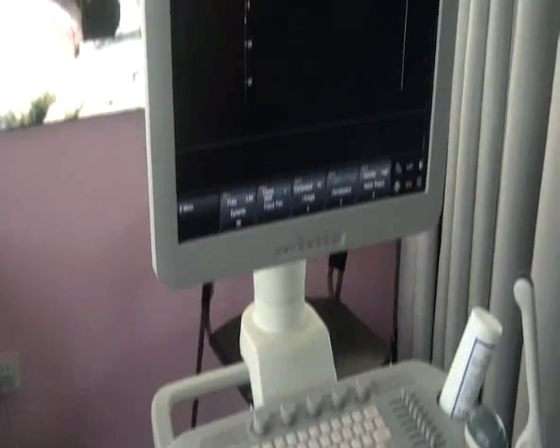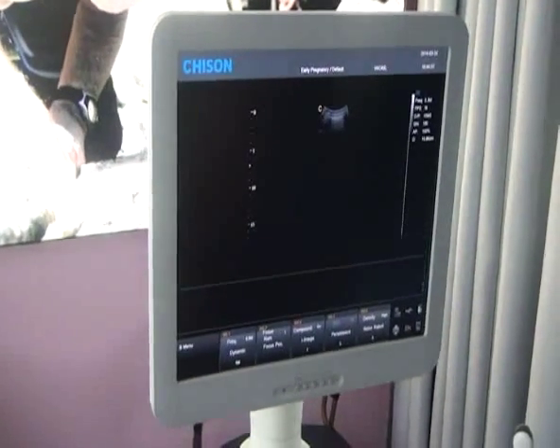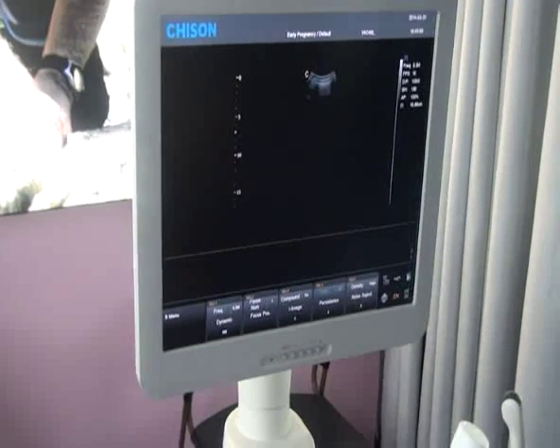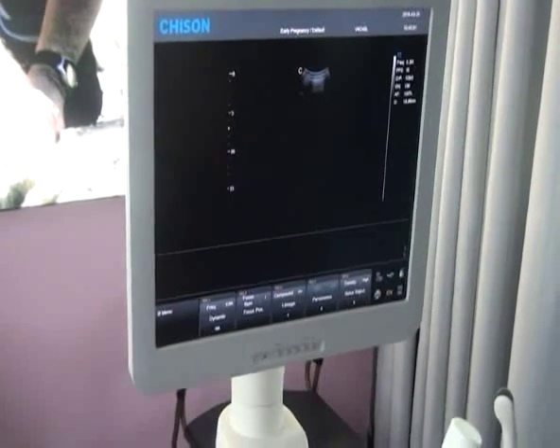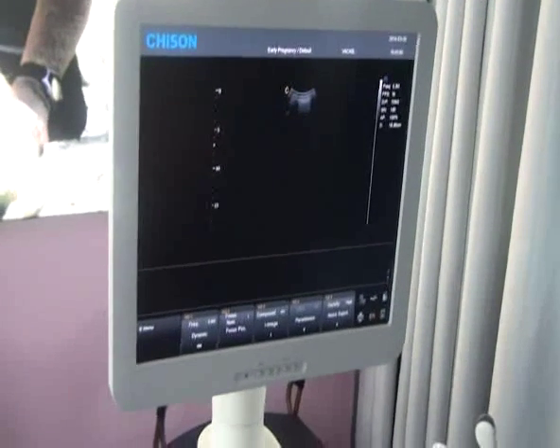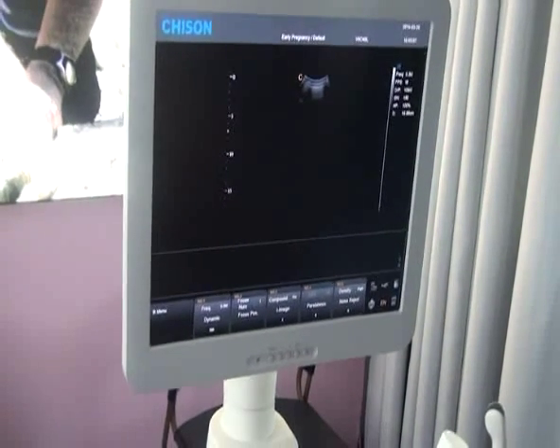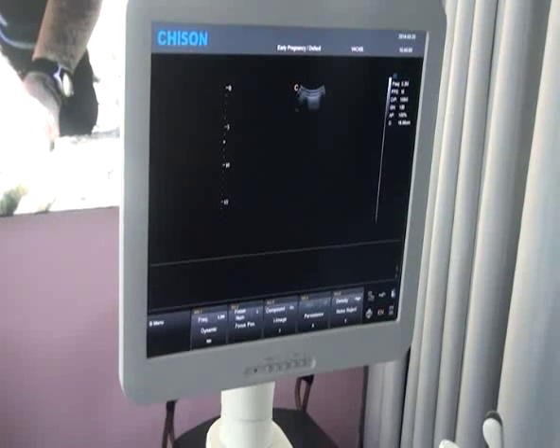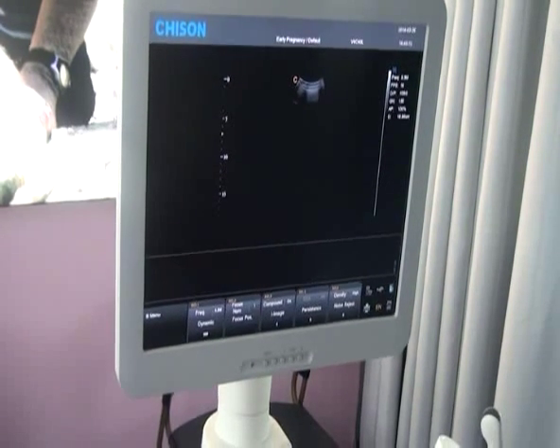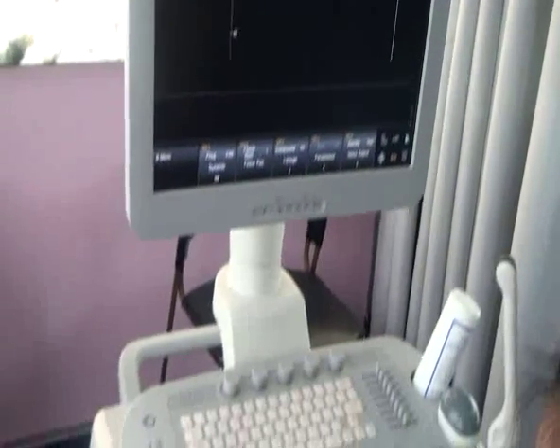Hello, thank you for choosing Chison. It's my pleasure to introduce the operation of I3. First, I will mainly introduce the parameters in different modes. Second, I will introduce the system setting. Third, I will take the 4D probe, for example, to introduce the operation.